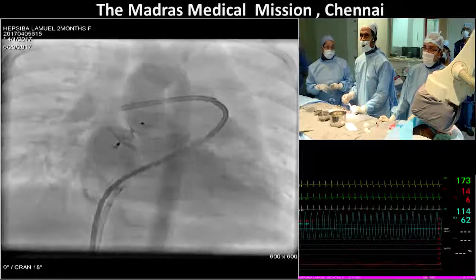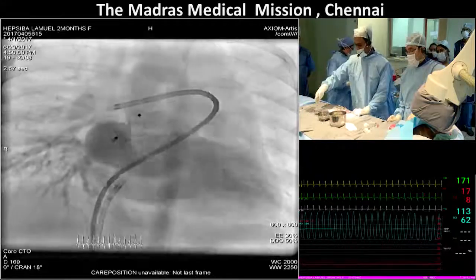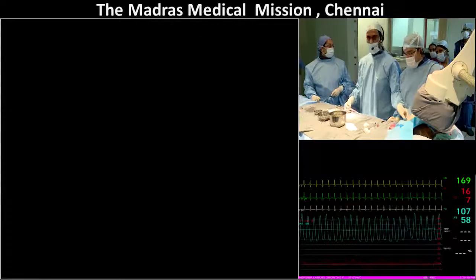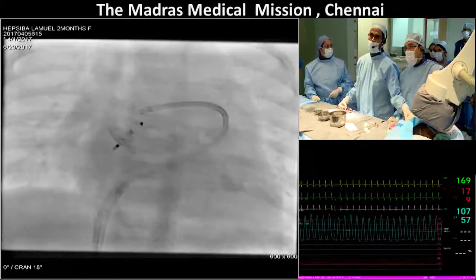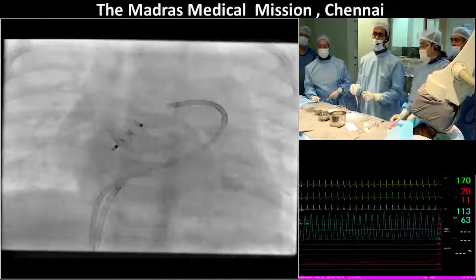Any comments from the audience here? There's a comment back there. Shiva, Nick Hayes from the UK. Fantastic results. I'm just wondering, how did you decide on using an ADO2? Did you think about using just a septal occluder, a small septal occluder? That would have been quite flat too. How did you come to a decision about using that particular device?